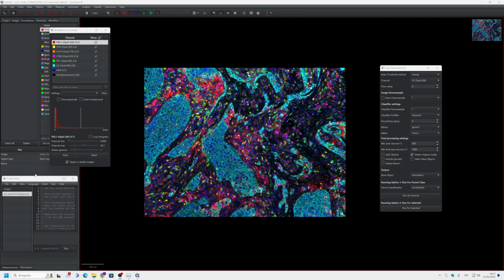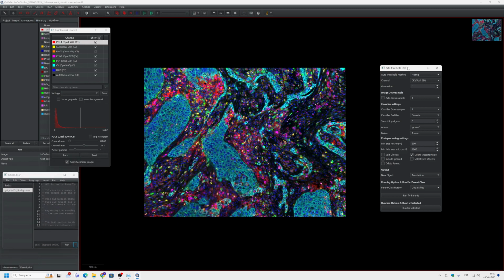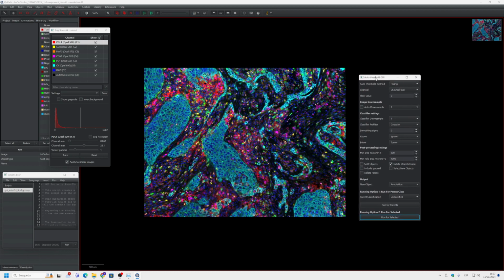Hello, Isaac here. This is a short video just to show the functionality of this script, which creates a graphical user interface to apply auto-threshold methods in QuPath.